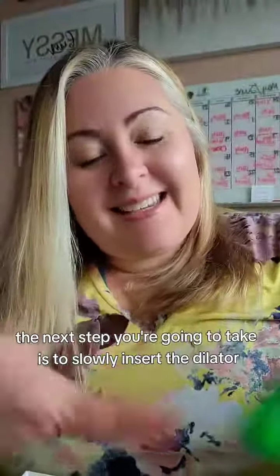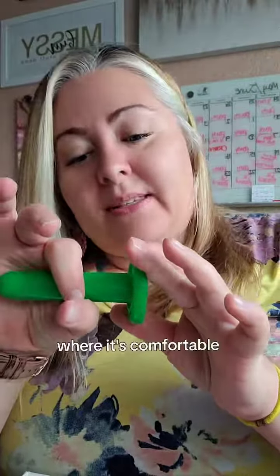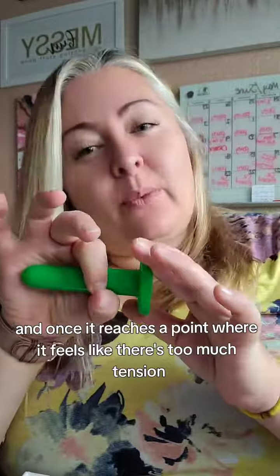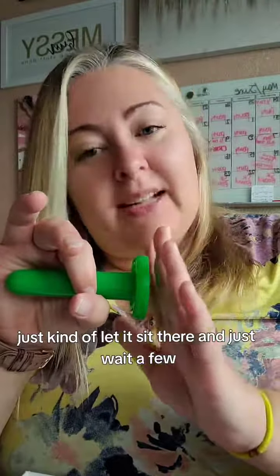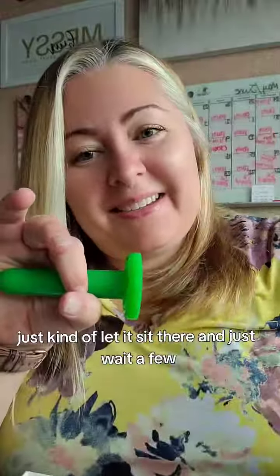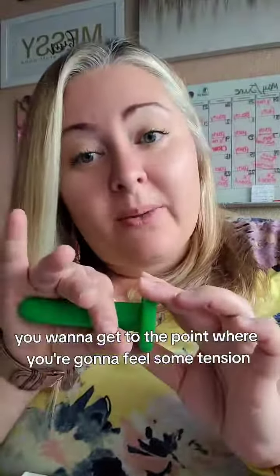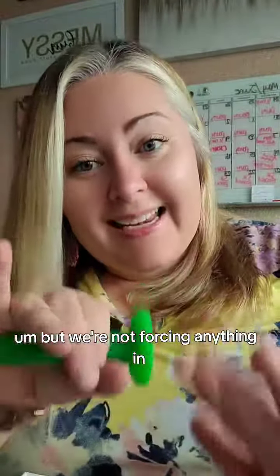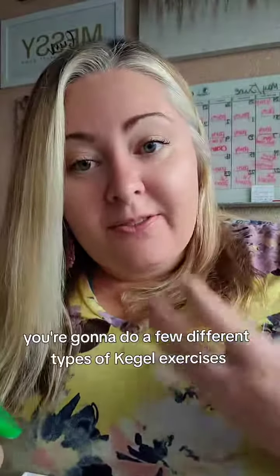The next step you're going to take is to slowly insert the dilator where it's comfortable, and once it reaches a point where it feels like there's too much tension, please don't force it in. Just kind of let it sit there and just wait a few. I want to reiterate, you want to get to the point where you're going to feel some tension, but we're not forcing anything in.